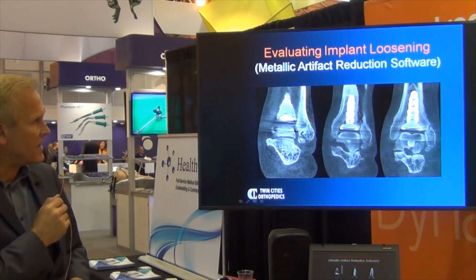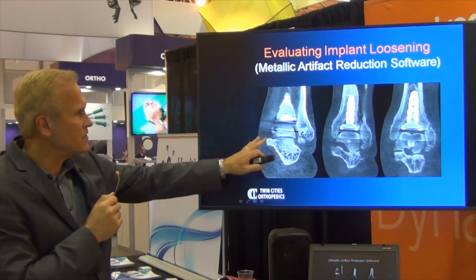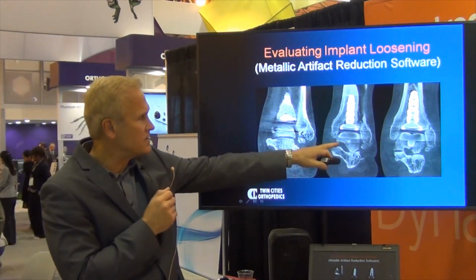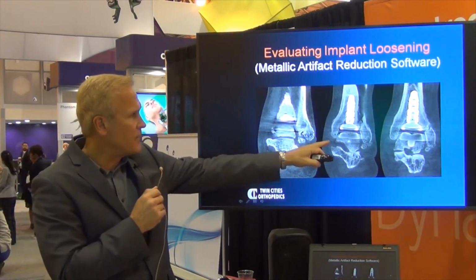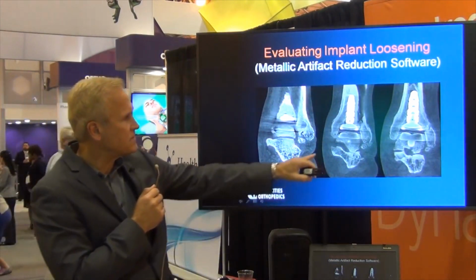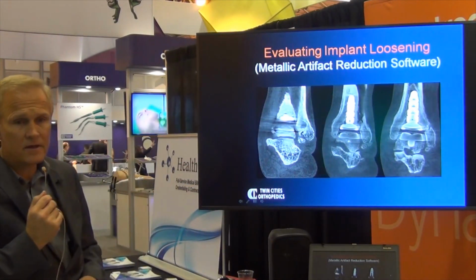Here's a failed total ankle arthroplasty, or I should say a persistently painful total ankle. And I didn't know for sure. I knew the tibial component was loose. I just didn't know about the subtalar or the talar component. So I wanted to get a CT scan. There's a lot of metal in that ankle joint. I wanted to see whether or not there was any still bone connection between the talus, the remaining talus, and the talar component, and whether or not there was any fracture underneath that talar body as well.